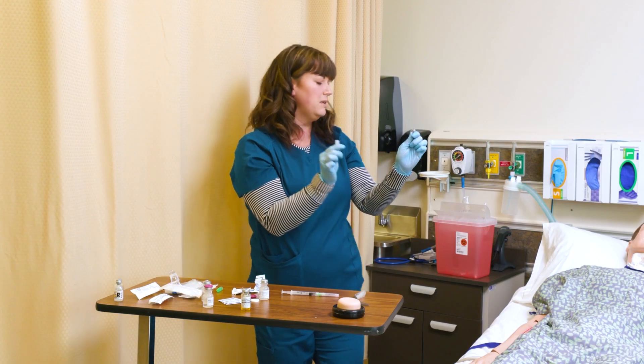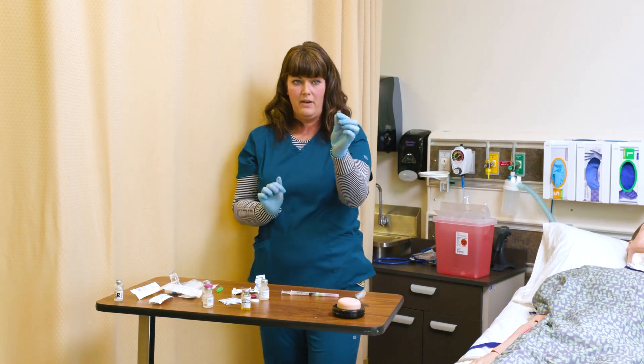Sharps — this goes immediately into the sharps container. Now I have an open ampoule.